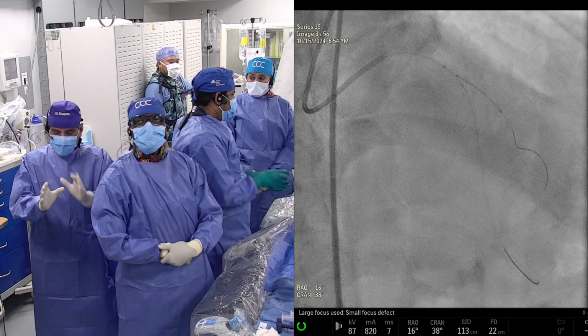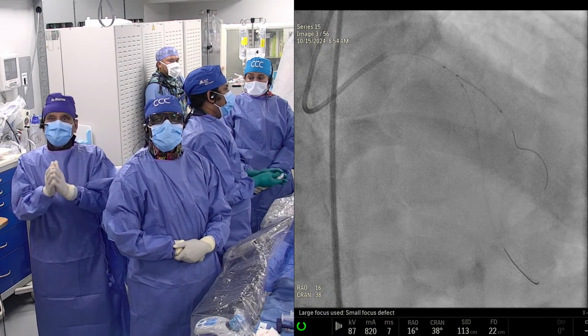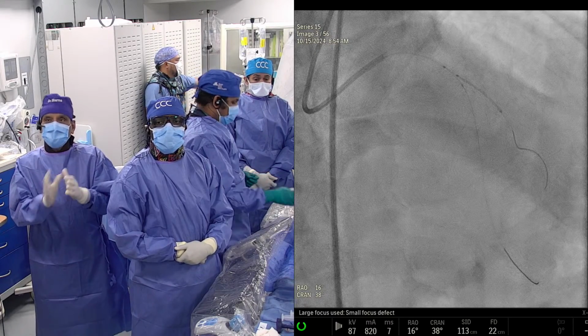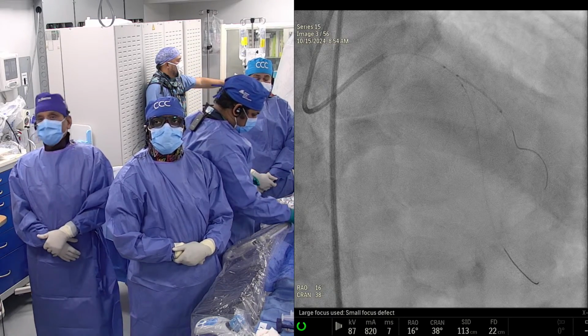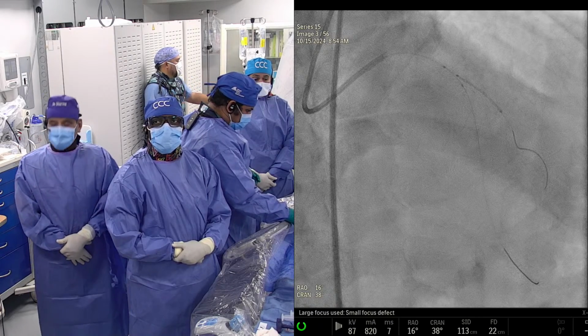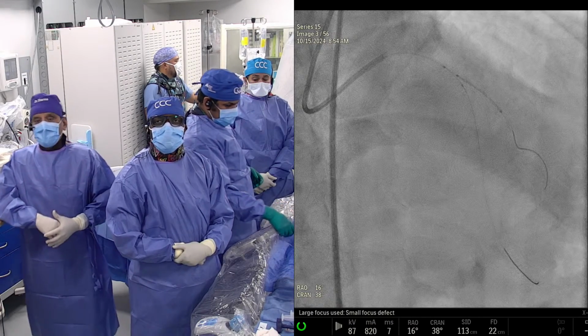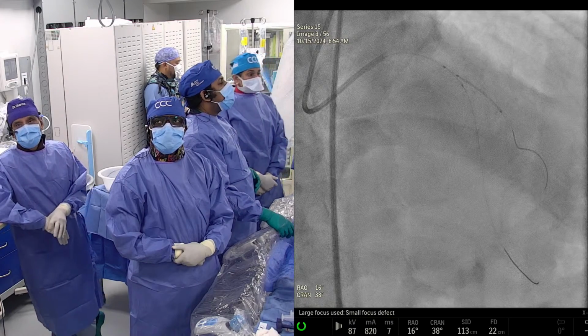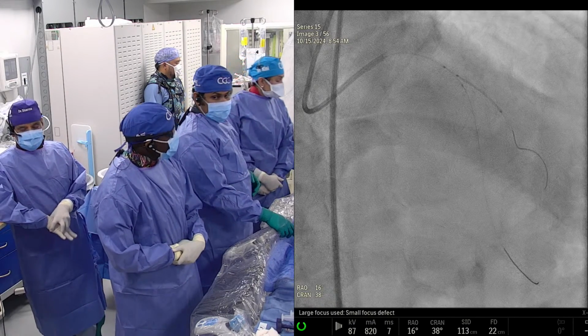And so the question is, what are your FFR measurements in this acute situation when there is catecholamine, there is vasospasm? The FFR could be falsely negative. Right. So that's basically, I would say, the only answer in the MI setting versus the stable setting of the FAME. Exactly right. Yeah, completely agree with that.